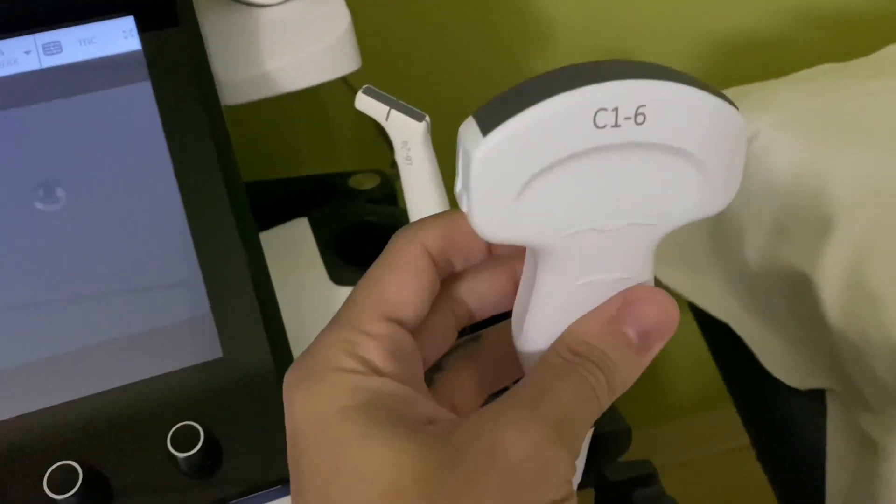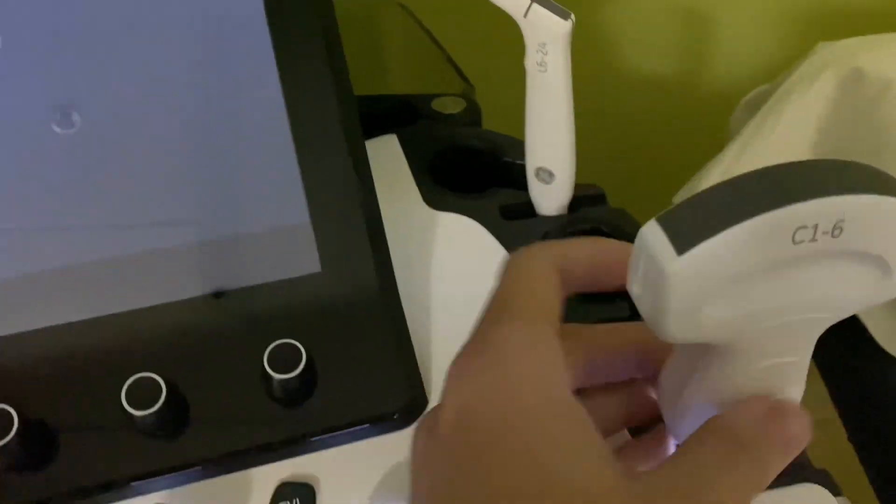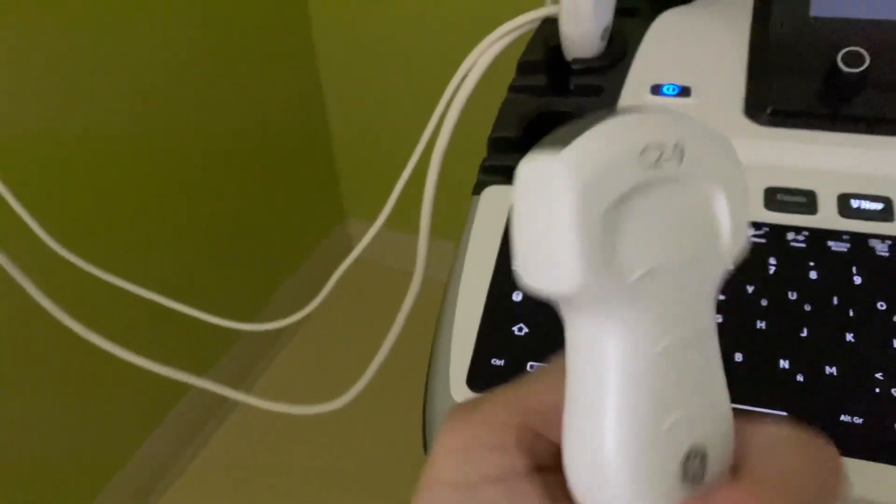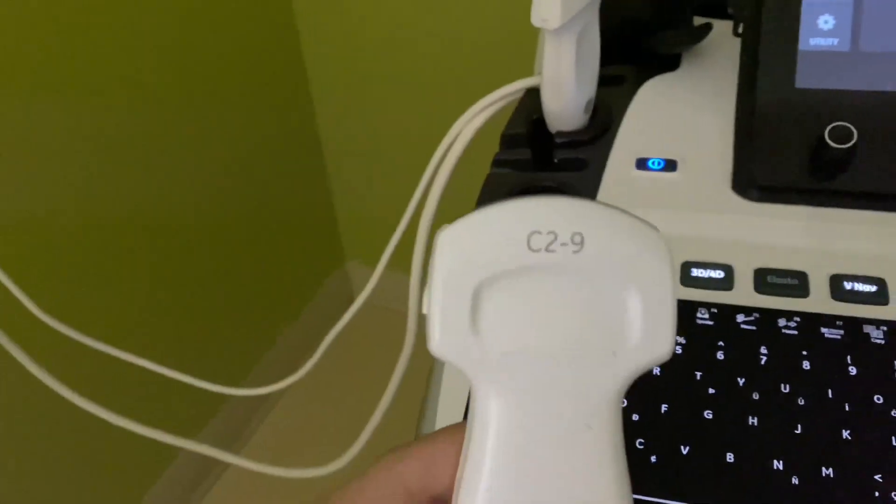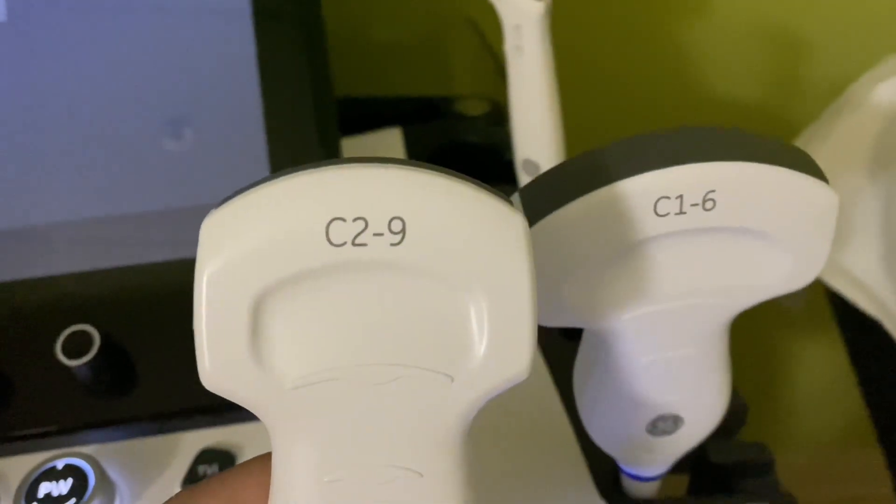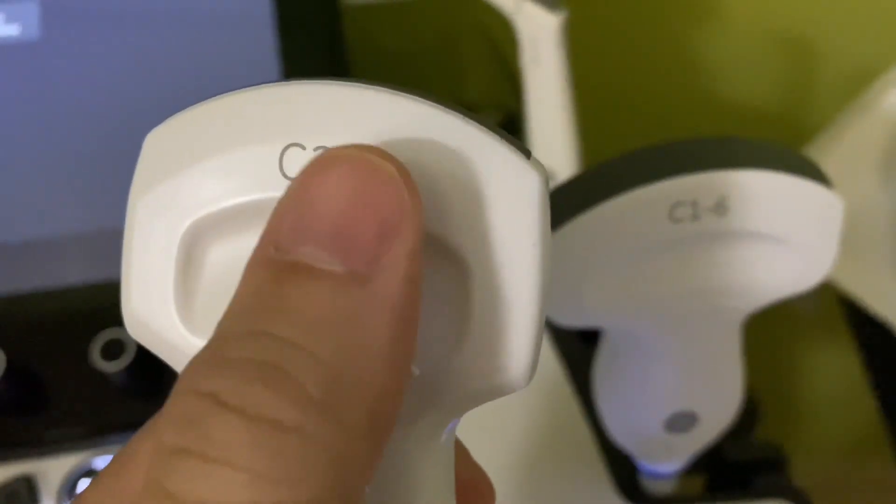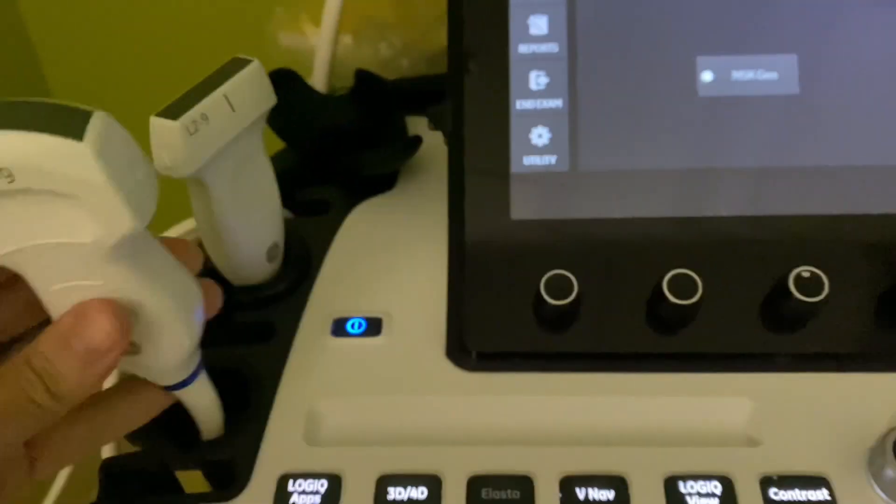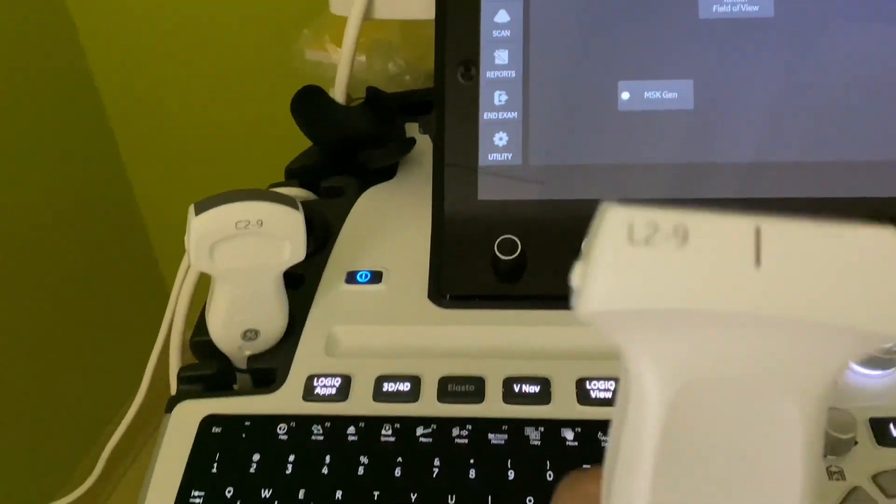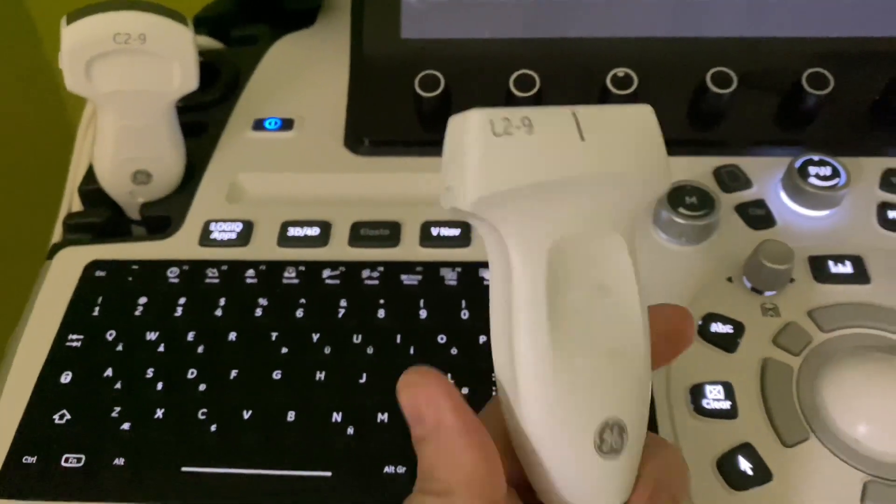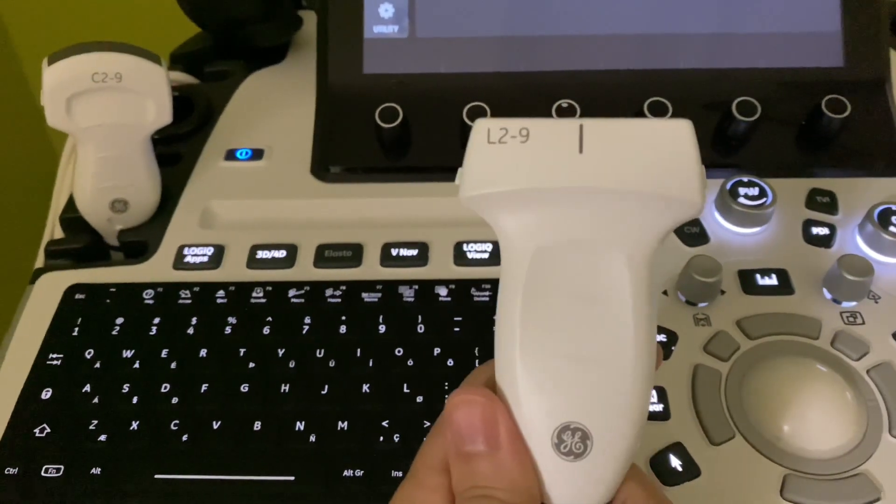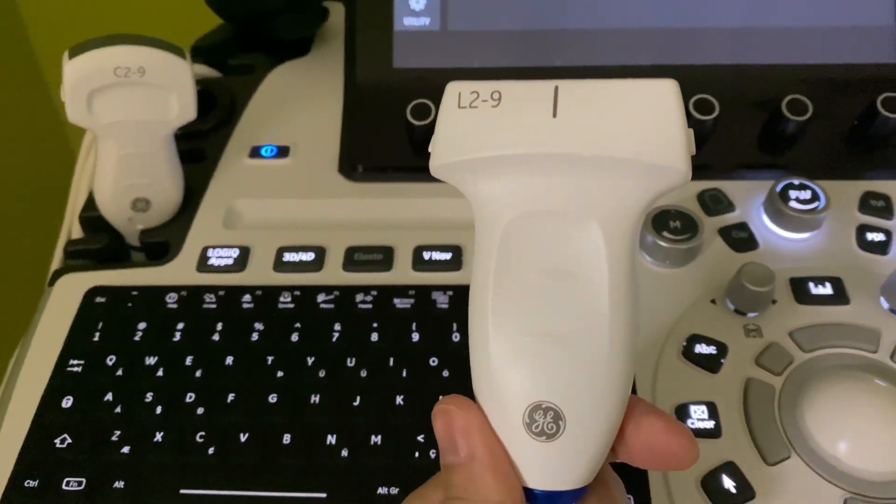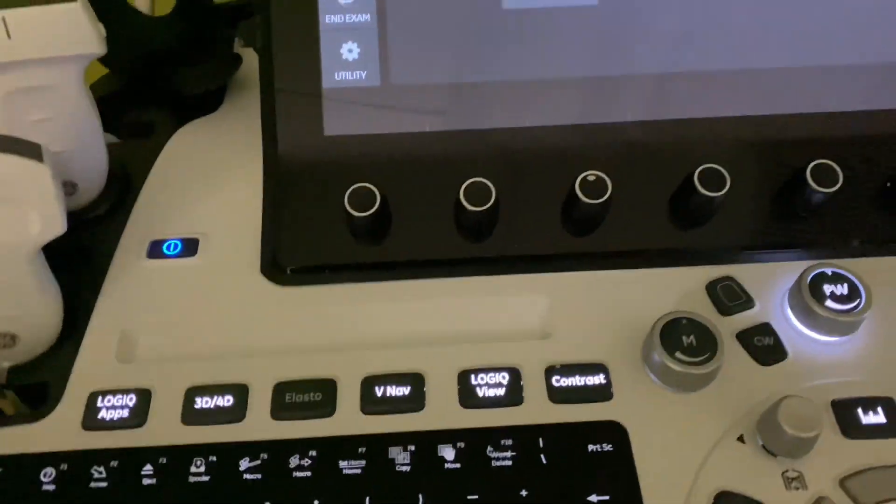All right, so the other transducers are the C29, which we had on the other machine too. This is used for pediatric abdomens and stuff like that. It's like the smaller baby version of this one that has higher megahertz, so it goes up to nine megahertz. Sweet. Then we have the L29, which I suppose is the new version of the 9L. And I've already used it and it takes very very beautiful pictures. I'll try it out right now.